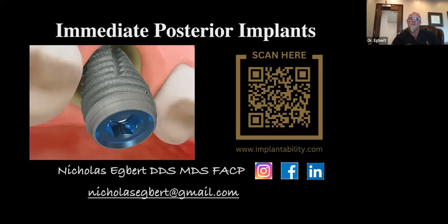Got another good question. So sub-G, highly polished zirconia, but no glaze. That is correct. And that's well documented in the literature. It doesn't even need to be. Think of all of the crowns that we see that have recession around them. Most of them are old PFMs, and that's proof, or even the zirconia crowns, that's proof that tissue does not attach to that surface. Where we do know that titanium and also the zirconia will attach to tissue, because as you remove those components, they might rip a little bit, they might bleed a little bit, and that shows that attachment is there.